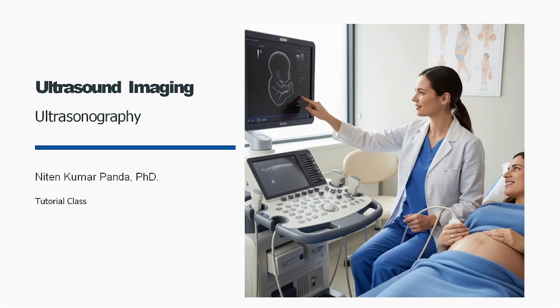Hello. Today we'll discuss ultrasound imaging, or ultrasonography. It is a non-invasive method and also non-ionizing, because previously we have studied X-ray and CT scan. In those cases we are using X-rays as the energy source, which are ionizing in nature.